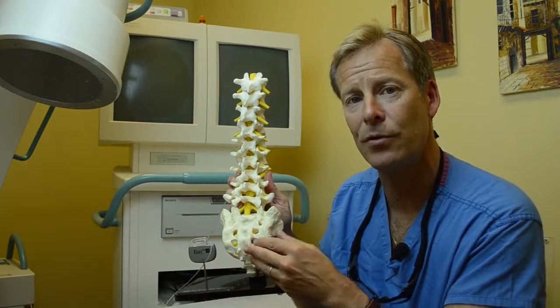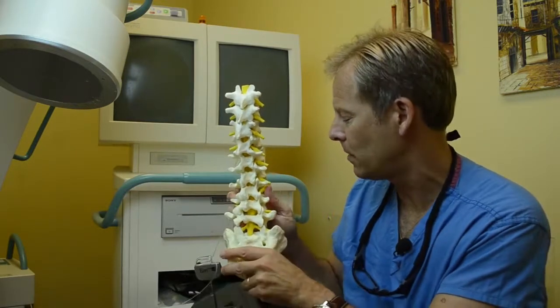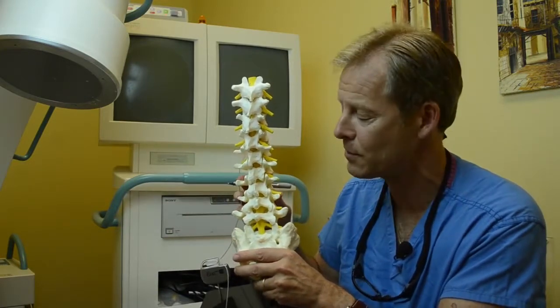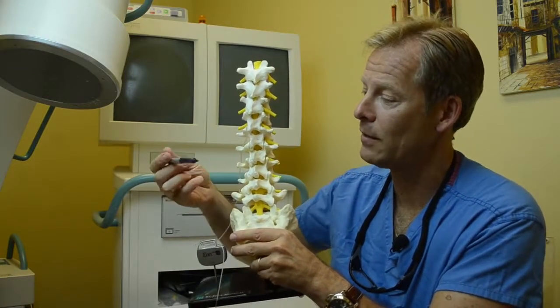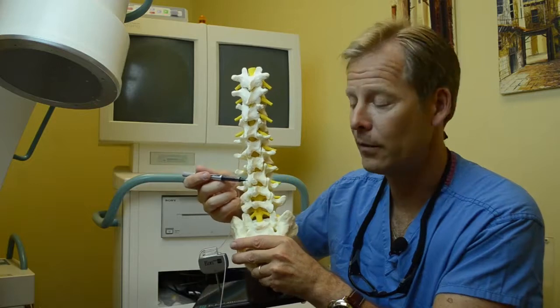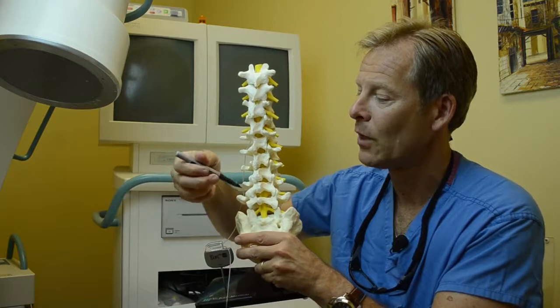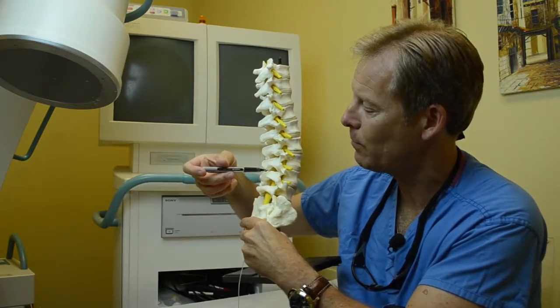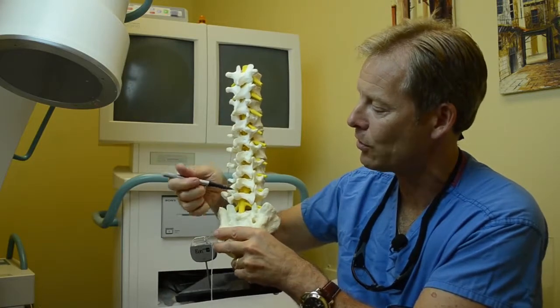Anesthesiologists do epidurals every day, such as in the OB suite. This is done fairly straightforwardly in an office-based setting like we are in today, in a fluoroscopy suite. Once we determine you're the right candidate, we clean the area with a significant amount of alcohol and other cleansing agents, then anesthetize the skin with local anesthetic. Once the skin is anesthetized, we place the needle in between the backbones and identify the epidural space.